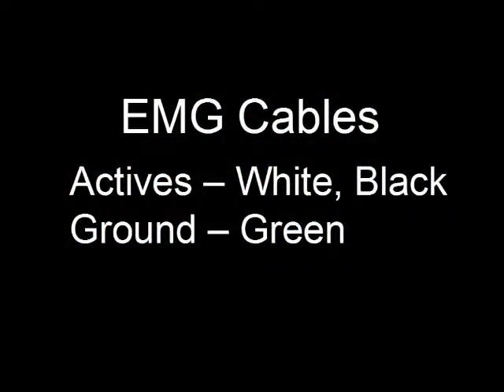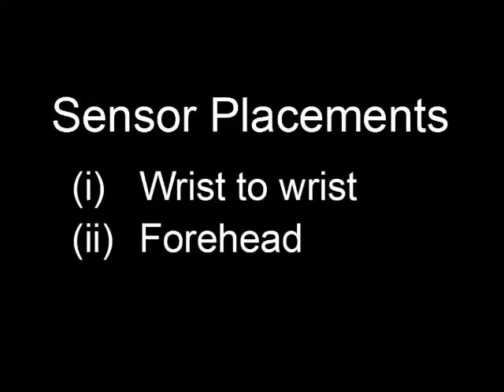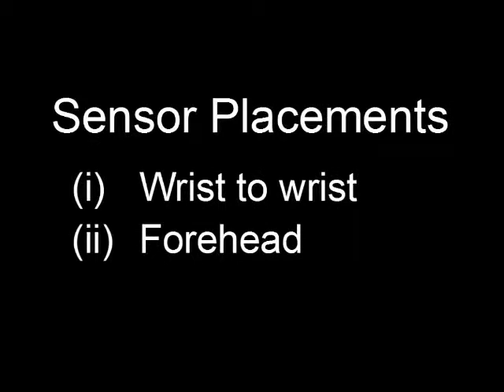The white and black sensors are known as the active sensors. In EMG, we're measuring tension between and around the 2 actives, so where we place them is important. The third sensor, the green one, is known as the ground, and its placement is less important. The 2 most common placements are firstly the wrists and secondly the forehead.